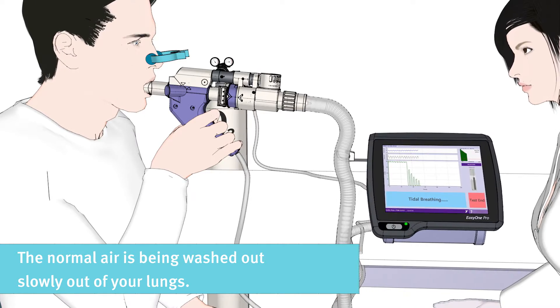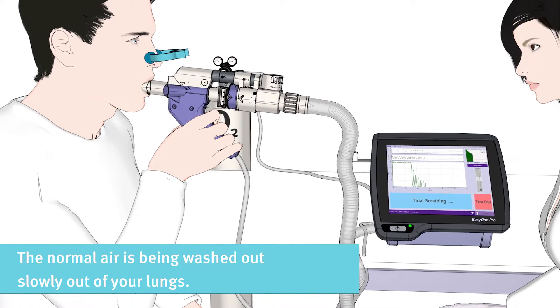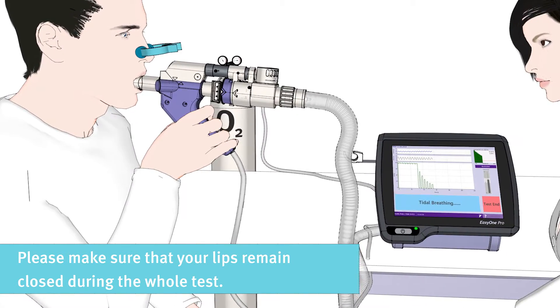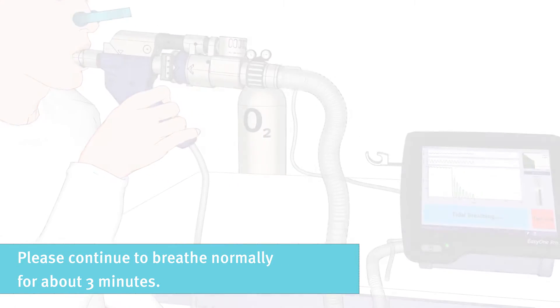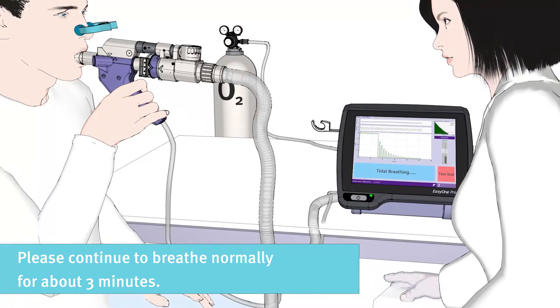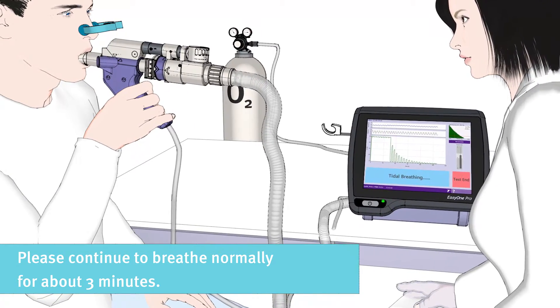The normal air is washed out slowly from your lungs. Please make sure that your lips remain closed during the whole test. Continue breathing normally until all normal room air has been washed out of your lungs.